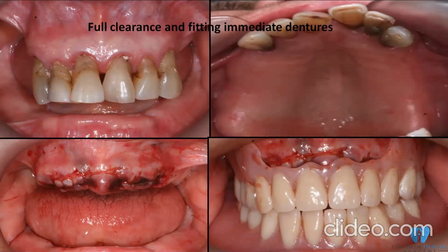My approach was a little bit drastic, I would say, but I think that's what we discussed, and we found that dental clearance, upper and lower denture. And that's why I talked in the beginning of the talk that we need to remove the flange in order to get better lip support. And these are gum-fitted immediate dentures. But it's not too bad for immediate dentures. Good retention, good aesthetics, I think. Engagement is good. Occlusion is all right for full dentures. So I would not mind full clearance in such cases. As you can see, the bone is quite healthy, a big ridge. I would say class 4 in the classification, so it's nice.